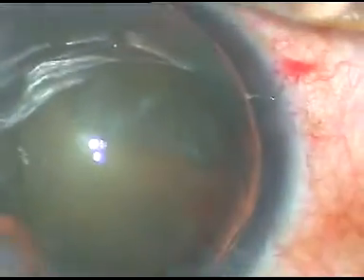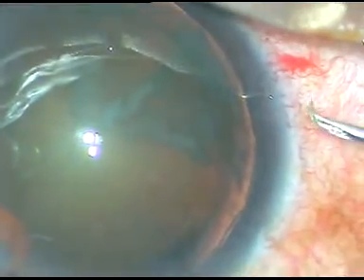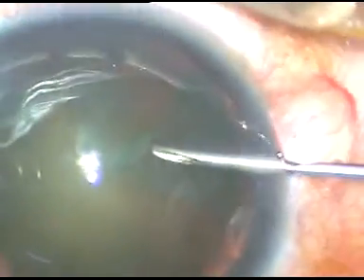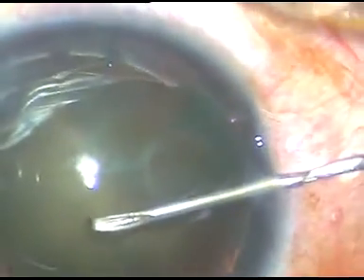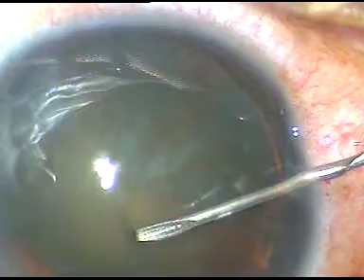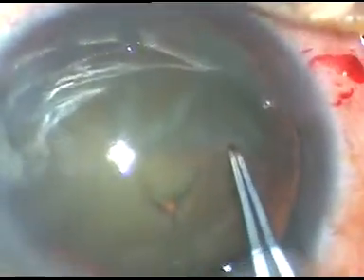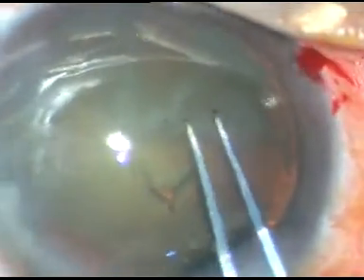Capsulorhexis is to be done. I incise the anterior capsule with a 26 gauge bent needle like this. And now I complete the rhexis with the help of a Utrata forceps. I introduce the Utrata forceps. I rest against the anterior lip, that is, I tent the anterior lip of the main incision, and leakage of viscoelastic substance becomes very minimal.